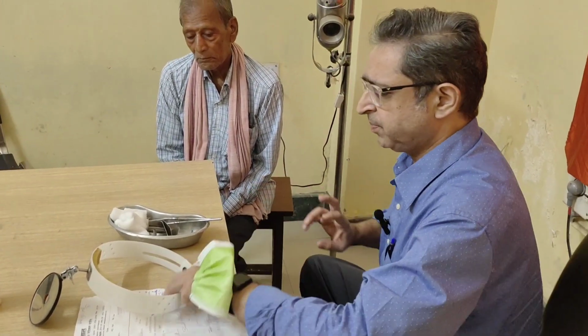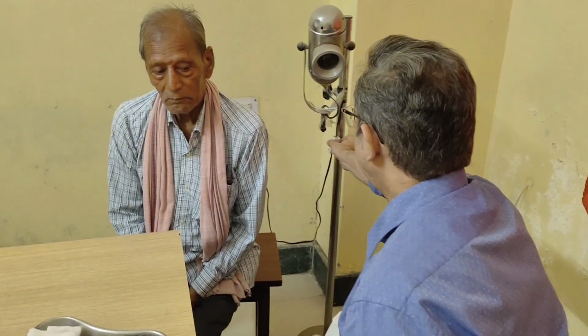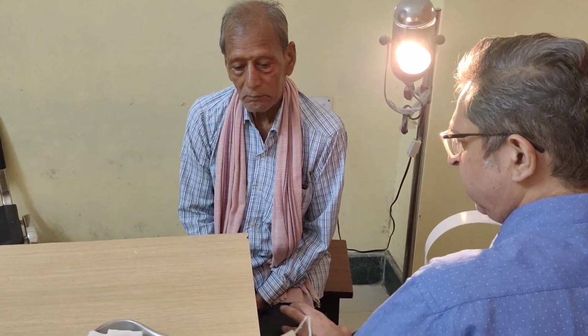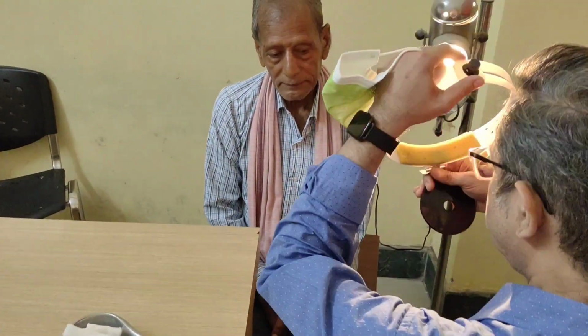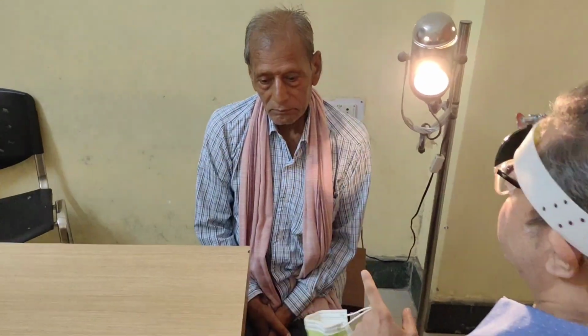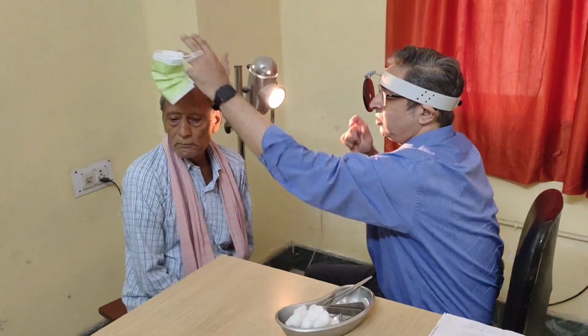First, the basic idea: the bullseye lamp is to be put on, and it has to be over the left shoulder of the patient. You have to keep your legs folded. The patient also has to have folded legs, and the position is made such that the bullseye lamp and your head mirror are aligned.